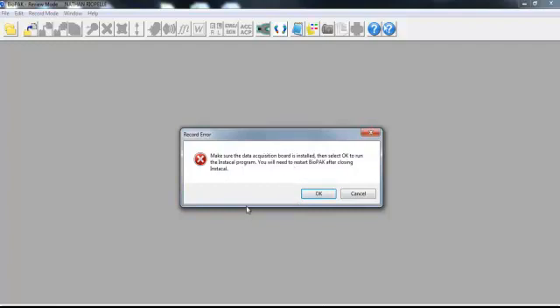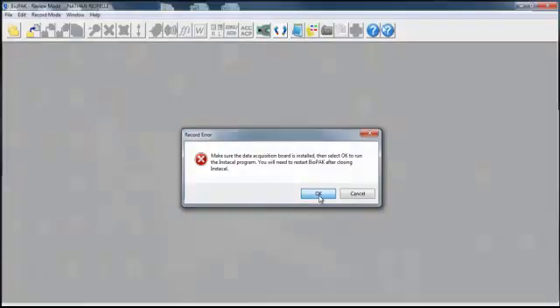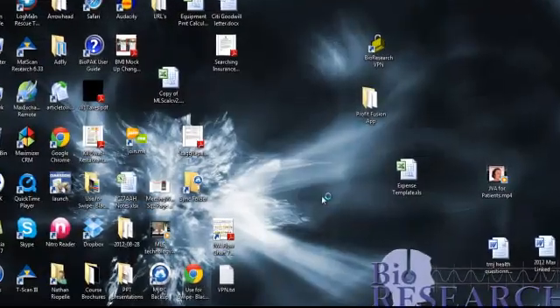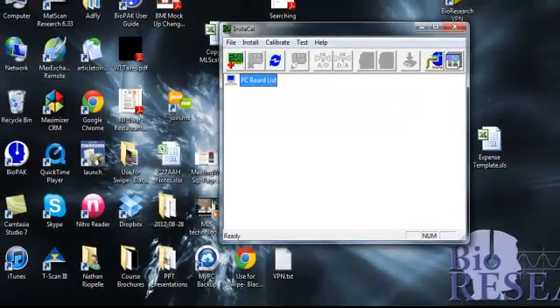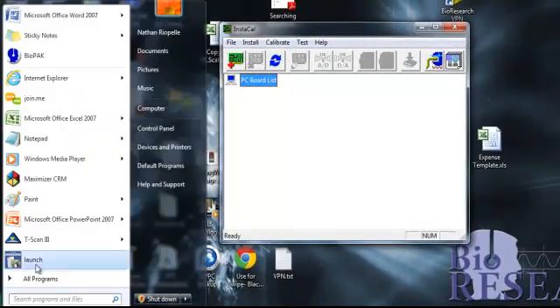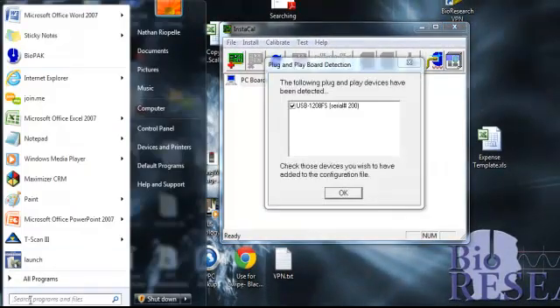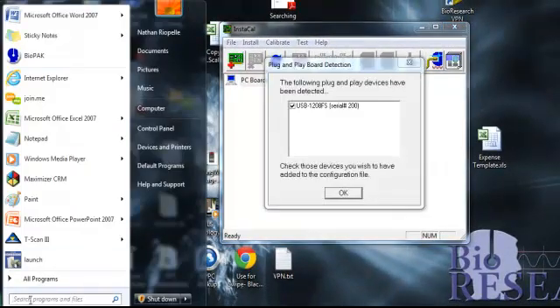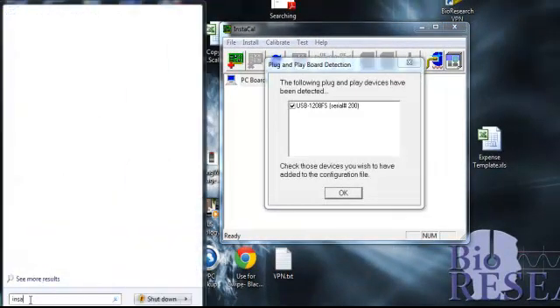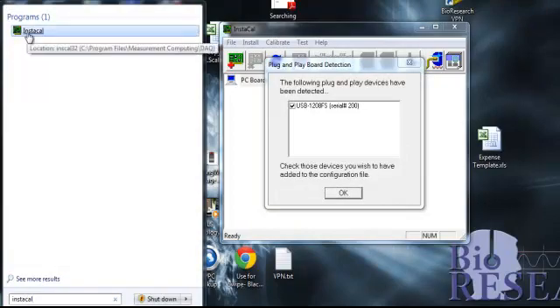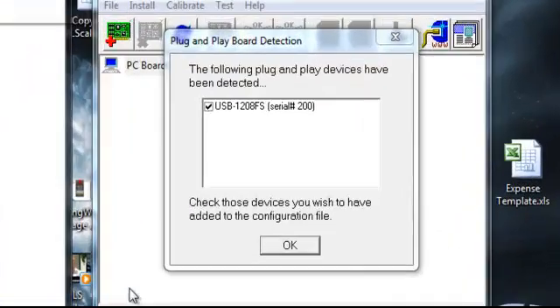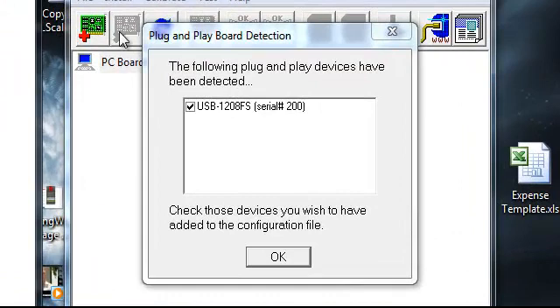All you need to do right here is click OK, and the Instacal program should automatically open up. Now, if it doesn't, go ahead in your search here, in your programs, type in Instacal, and it'll find it on your computer, and then you can also open it that way. But it should open automatically.